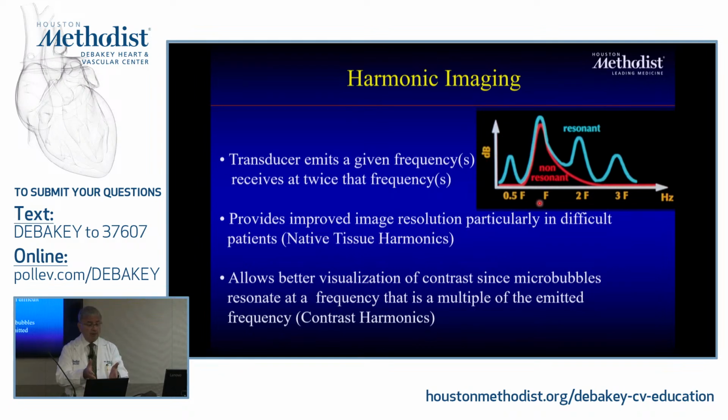So this harmonic imaging was being developed in the early days of contrast. Why? Because these little tiny microbubbles are very sensitive to energy. You send a fundamental frequency and they will emit 2 times or 3 times the frequency, so you can differentiate contrast from muscle itself. The interesting thing is a discovery that we never thought, that muscle, the myocardium, would also emit harmonics. Meaning if you hit it with ultrasound, it will also produce more than the fundamental.